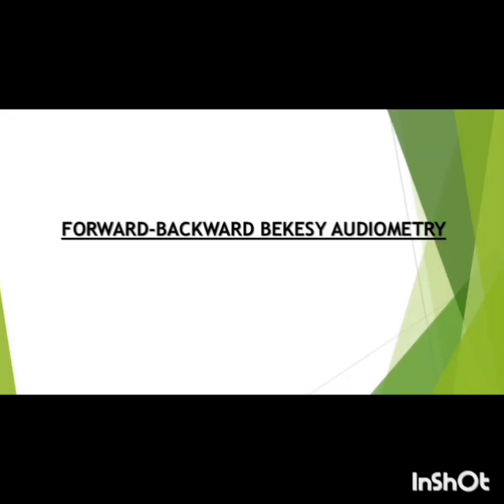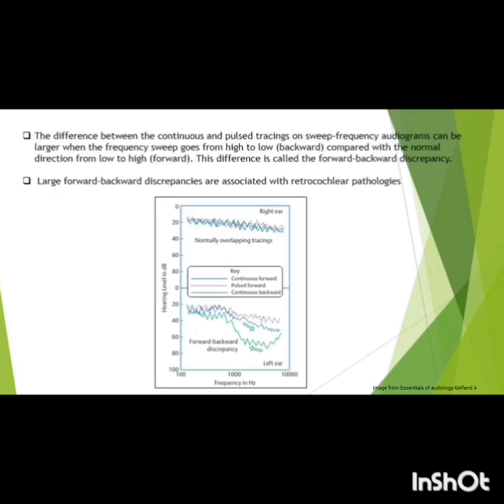Moving on to forward-backward Bekesy audiometry. The forward-backward Bekesy audiometry includes tracking of frequency sweep from high to low, that is backward, and low to high, forward. Forward and backward Bekesy audiometry is interpreted by considering forward and backward discrepancy. Large forward and backward discrepancies are associated with retrocochlear pathology.